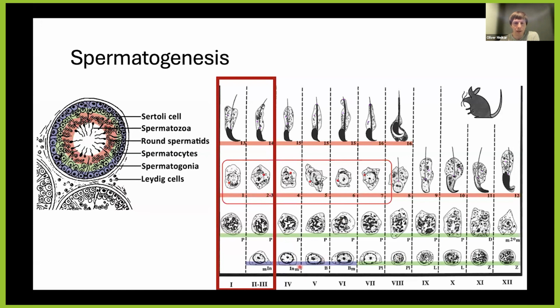So you see how the spermatogonia slowly divide and then start to differentiate into type intermediate spermatogonia, type B spermatogonia, pre-leptotene, leptotene. This is already part of meiosis. Then all the genomic rearrangements take place here, crossing over, and so on. And then haploid cells arise, which then start to really change in their shape. The tails start to develop, the acrosomal head. So eventually you end up with a spermatozoon.